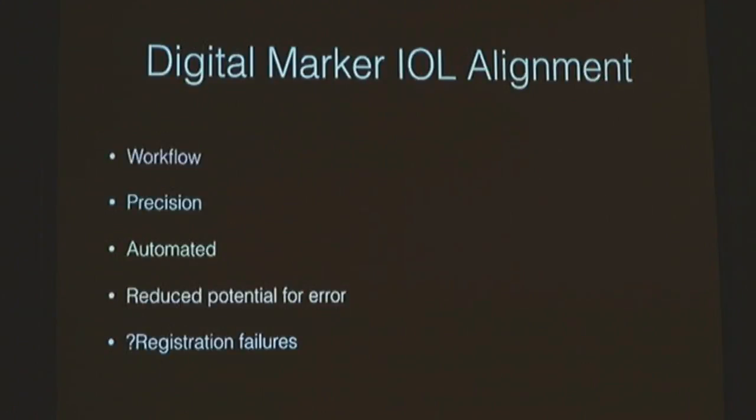So I think there still are questions. Is it worth the cost? Is it worth the value? I think these are all good questions. I think if you have a good toric marking system, you can probably do pretty well without it even. But this, of course, helps with the workflow and reduces the potential for error as well.